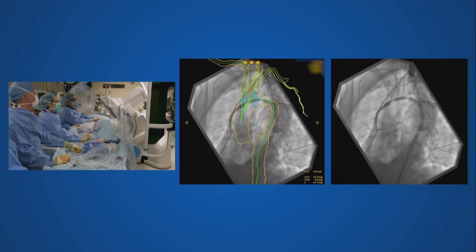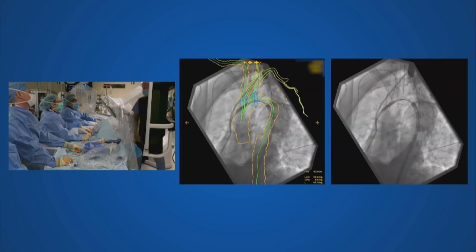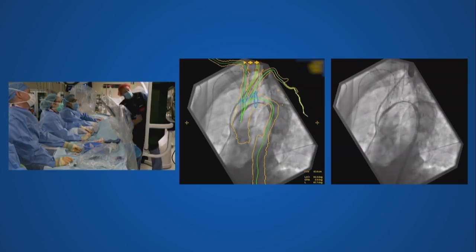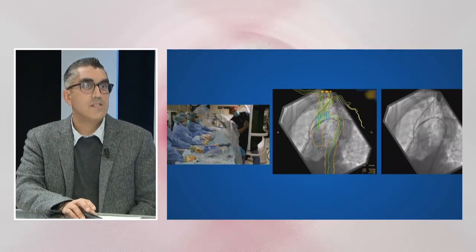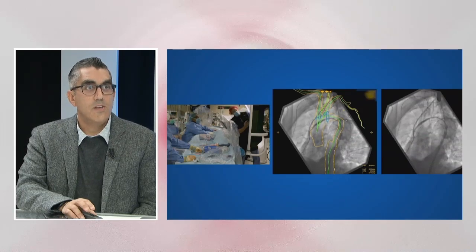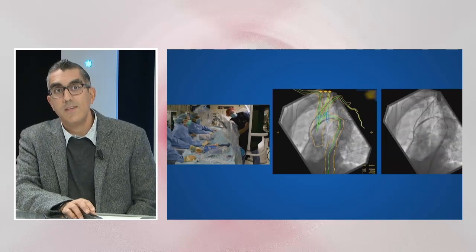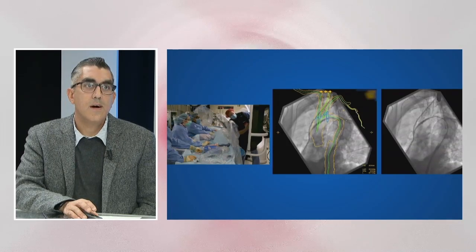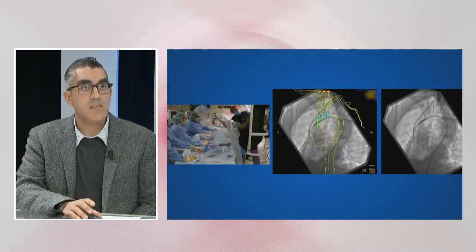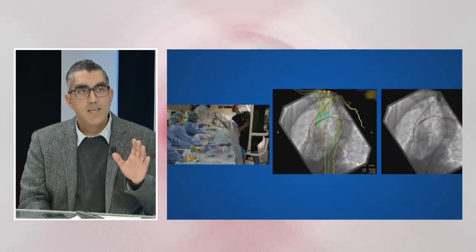We take a moment to make sure everything is lined up. You know you did it right because our rep is not putting a mark on the screen — we're pretty dead on at the subclavian. The device is deploying and we'll follow it with a second covered piece based on our Advantage workstation planning to cover the entry tears. There were two large entry tears requiring about 15 centimeters of fabric coverage, so the first two devices were fabric devices.